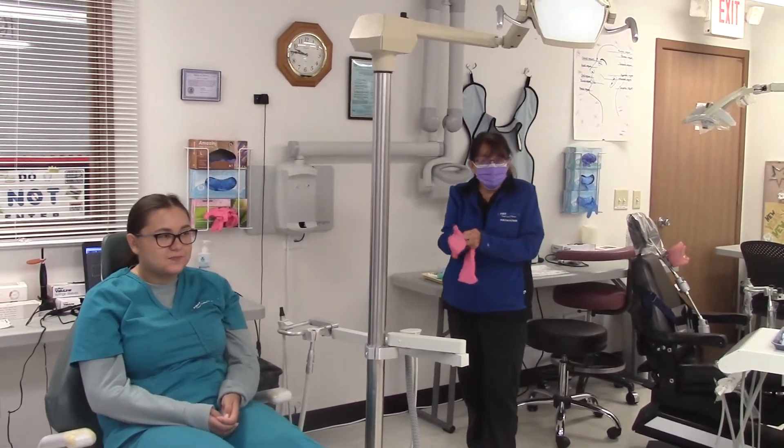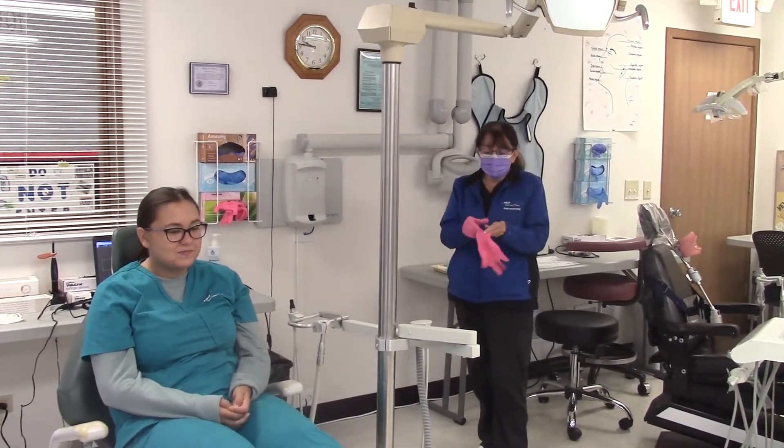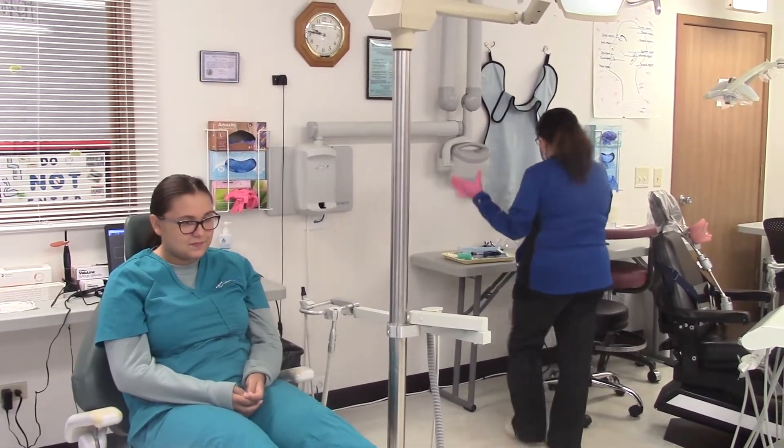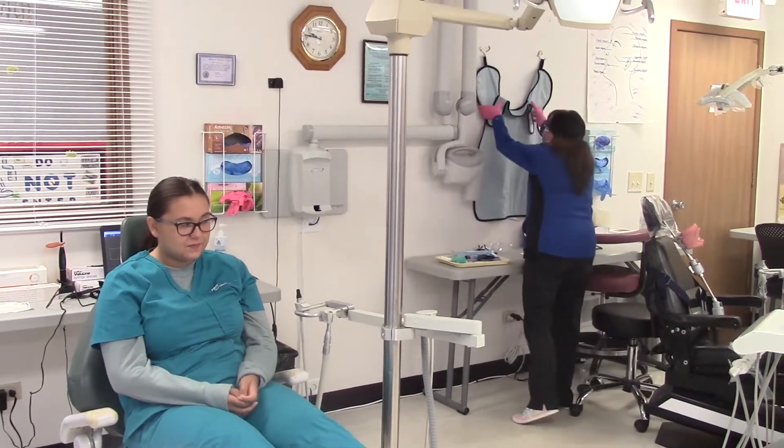We're going to be taking digital x-rays today, so I'm going to go through all the steps that we do. Of course, we want to put our gloves on and we need to put the lead apron on our patient.